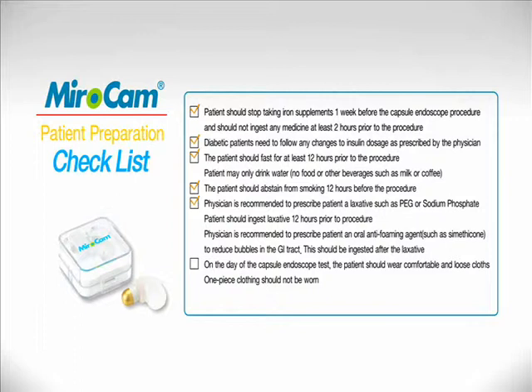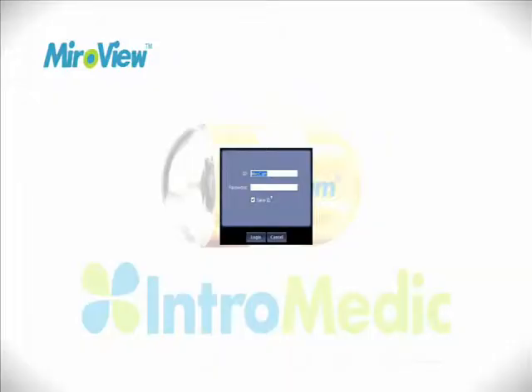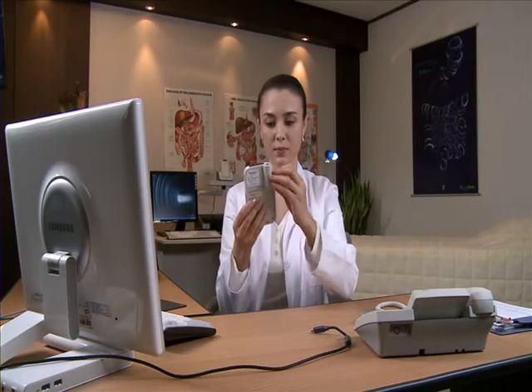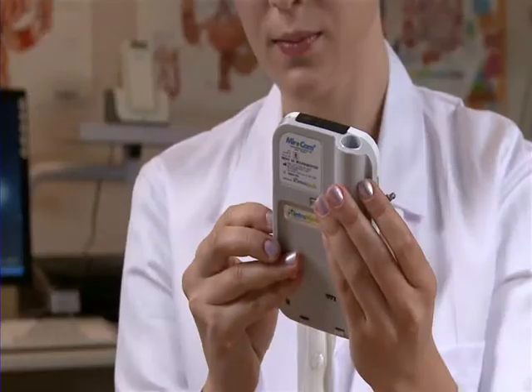Patient Administration: Confirm the patient has followed the preparation accordingly and begin the administration procedure. The nurse or medical practitioner should turn on the computer, start MiroView, and log in. Connect the receiver to the computer via the USB cable and make sure the receiver is turned on.